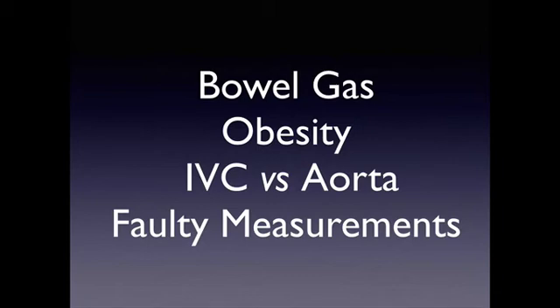But a lot of our patients are unable to turn. Obesity, again, firm pressure. And on the new machine, there are two bodies at the bottom right of the screen. One is a fat looking body and one's a skinny looking body. Those are the different body habitus settings. So if you're doing an exam on a larger patient, you want to choose the fatter image, and that just changes the penetration on the screen.